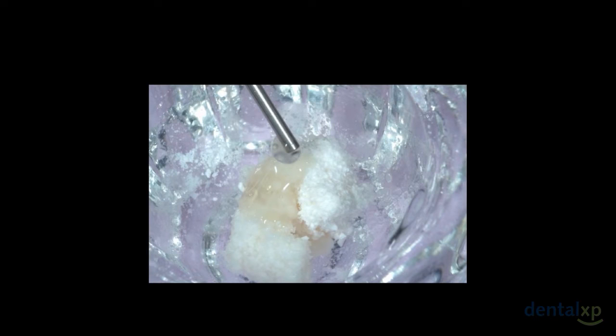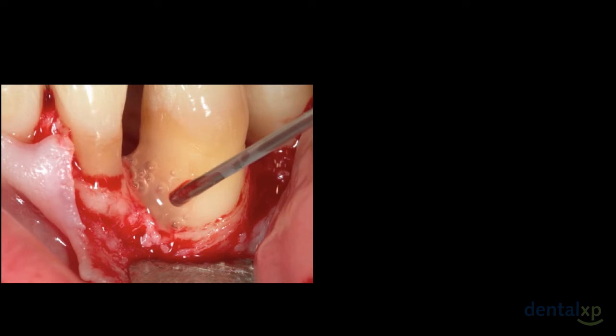Here I am taking the Emdogain and impregnating the BioOss collagen. I'd like to get the BioOss collagen totally 100% soaked in the Emdogain. Prior to the placement of my BioOss collagen, I have now placed the Emdogain in the circumferential defect.